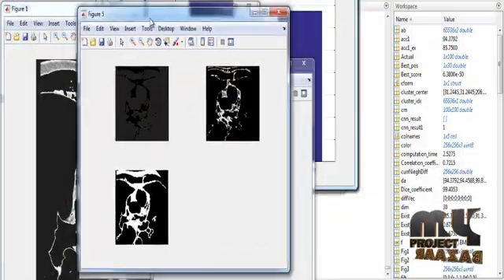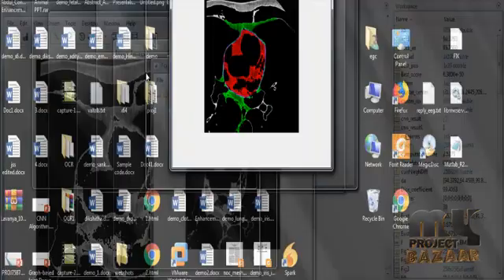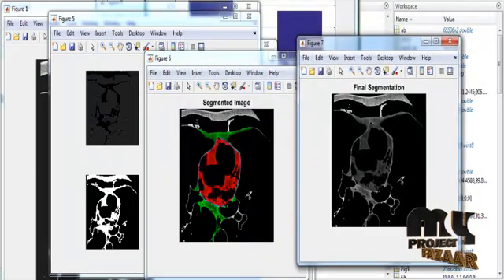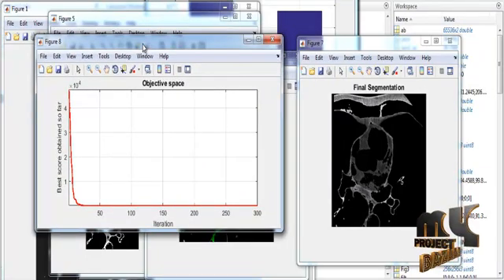After the labeling, the corresponding labeled image pixels will be segregated. Now we have the 3 labels. So here the 3 kinds of images will be obtained. After the clustering, the final segmentation results will be shown like this in figure 6. Now the segmented regions will be separated by means of the color segmentation. Then finally the final segmentation in grayscale will be shown like this. After that, the pixel values based on the iteration and the best score value will be shown in figure 8.